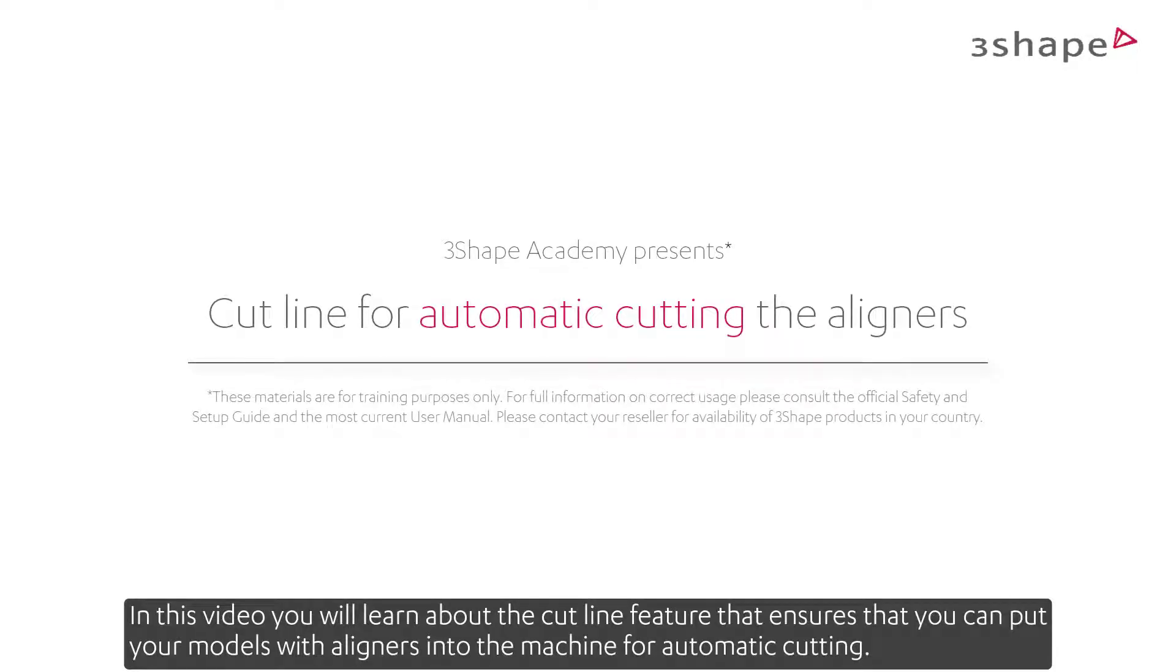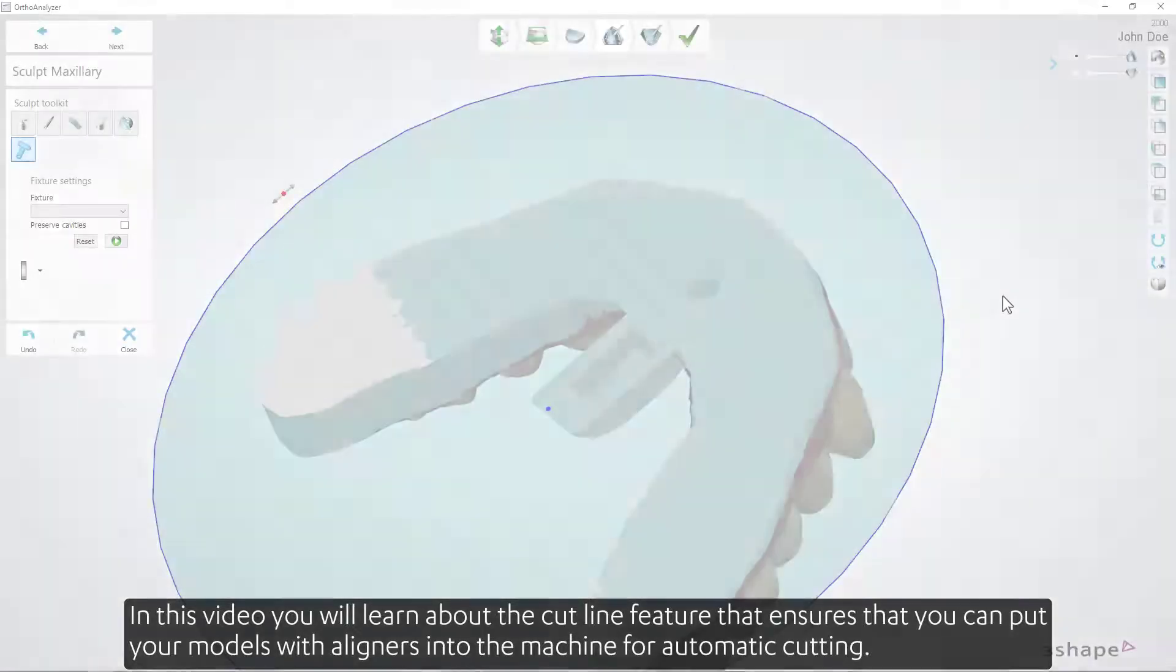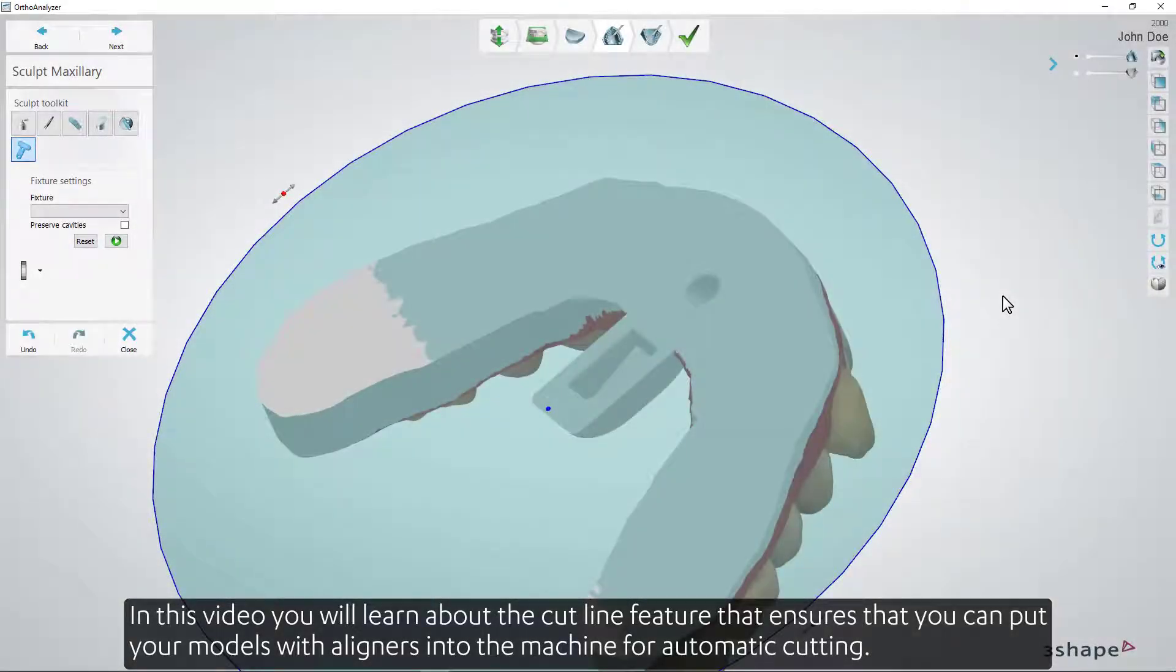In this video, you'll learn about the Cut Line feature that ensures you can put your models with aligners into the machine for automatic cutting.